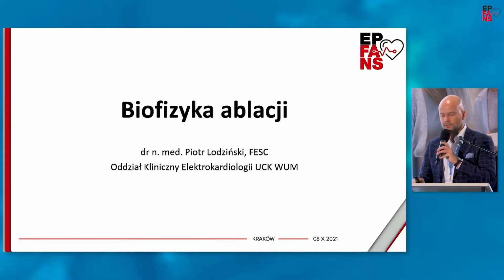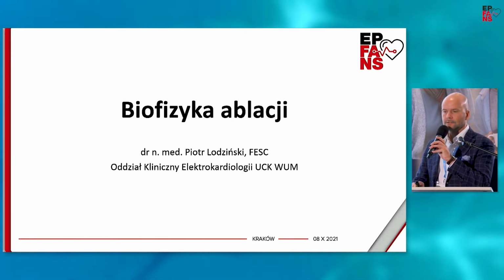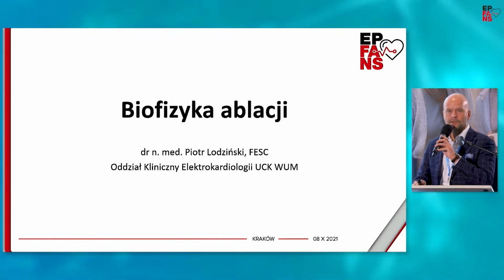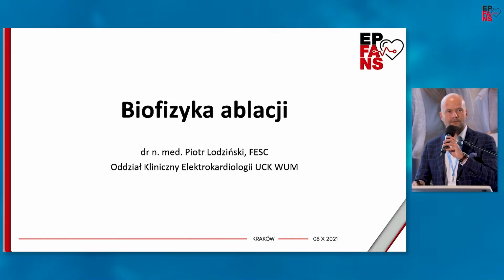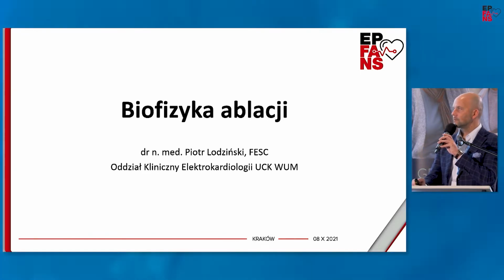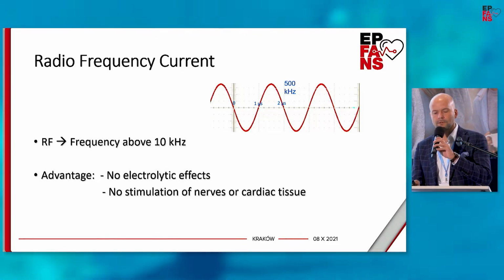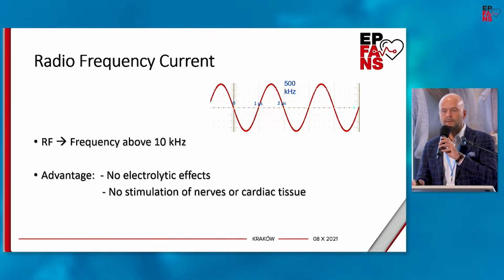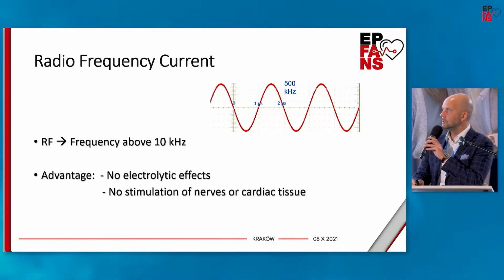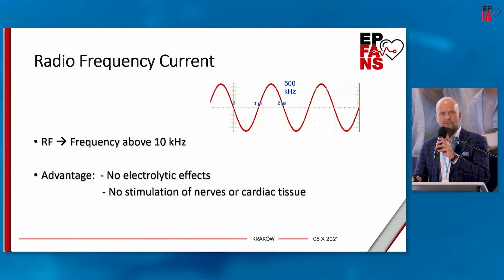In every EP lab nowadays, we have plenty of different screens full of colorful images. Today, we put some more attention to radiofrequency generator panel with power and temperature setting, impedance and temperature readings. The most frequent source of energy ablation is radiofrequency current. During this presentation, we'll focus on this ablation technique. Today, we'll skip cryoballoon part as we are limited by the time of presentation.